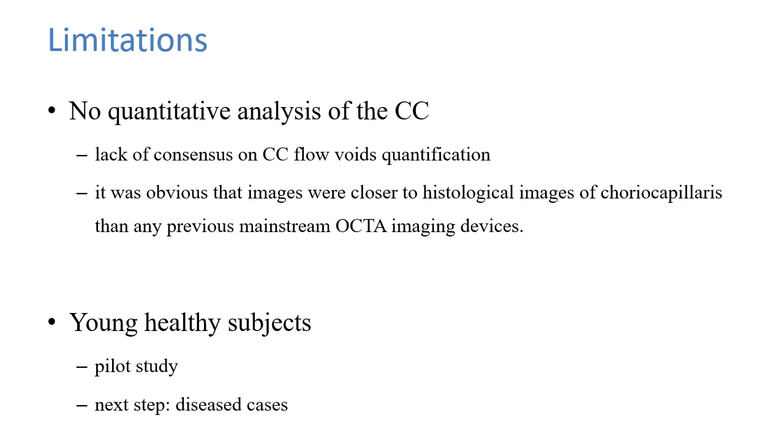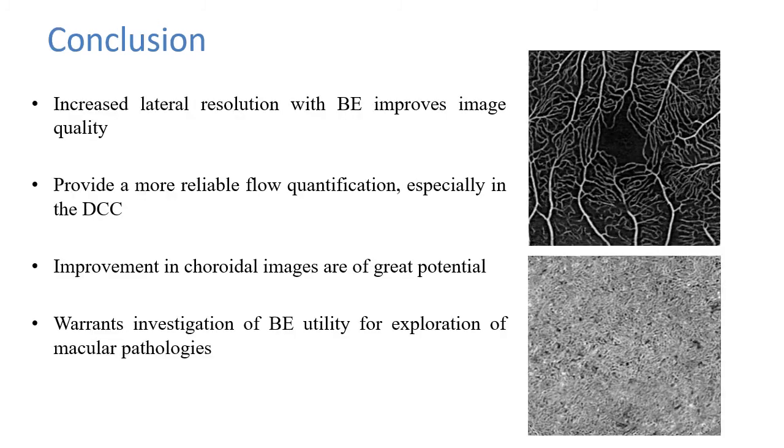Another limitation could be that we only did this imaging in healthy patients, but of course this is the first time this technology is tested. So this is a pilot study, so it needed to be done first in healthy patients. Now that we have all this information, the next step is of course to go to diseased cases.